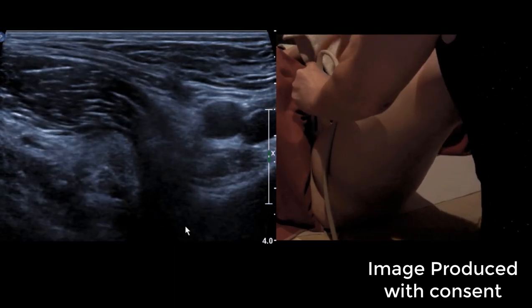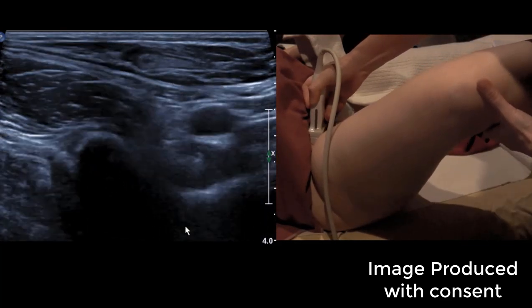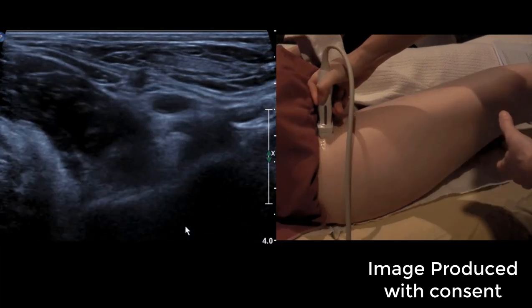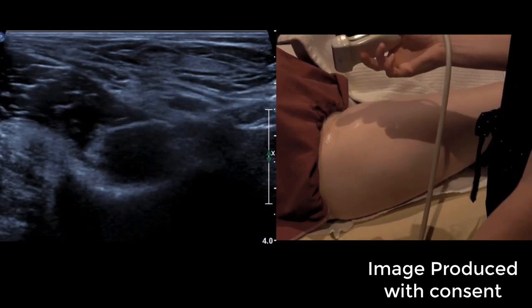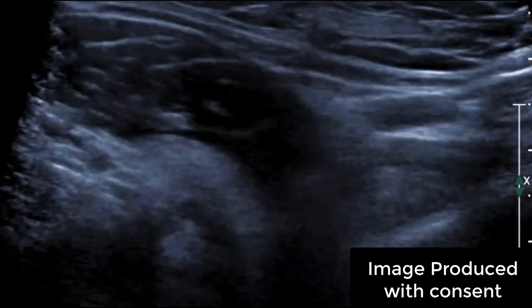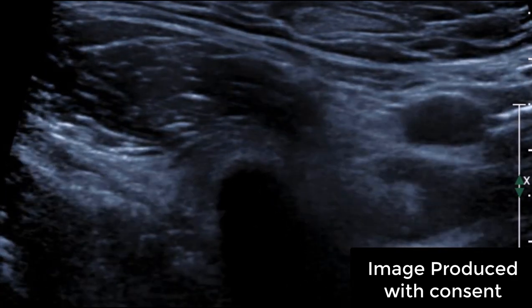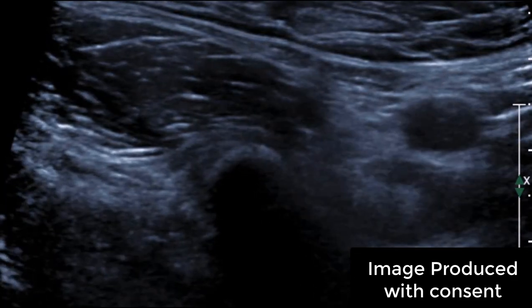It doesn't matter if you lose it momentarily, so I've just swapped my grip to the inside. So the bit we want to see is now. Going to get you to do one smooth movement and adduct the hip like a breaststroke kick. And you could feel that under the transducer. So I'll wind it back so you can see it. So we can trim that and we'll play that little video. So, nice example.